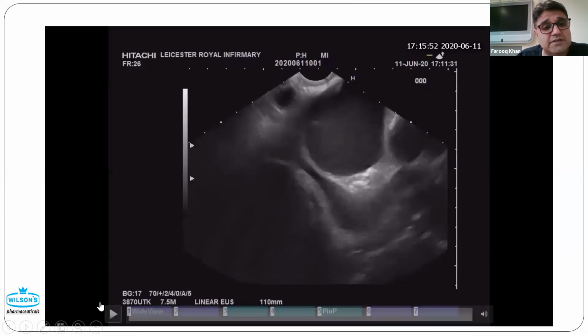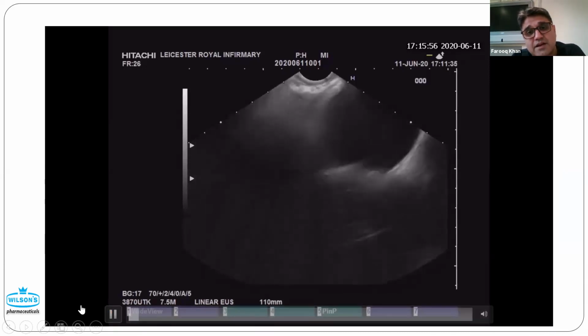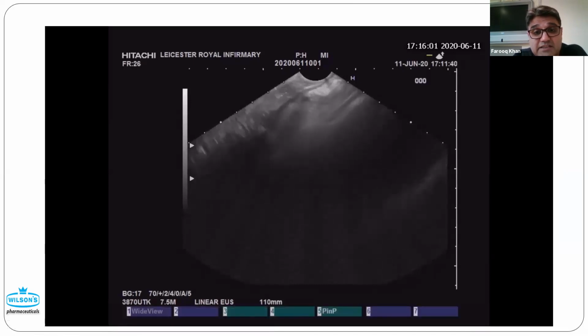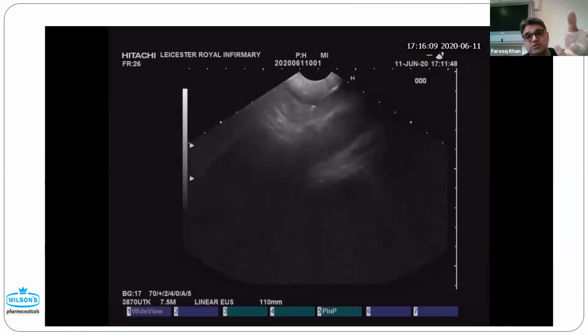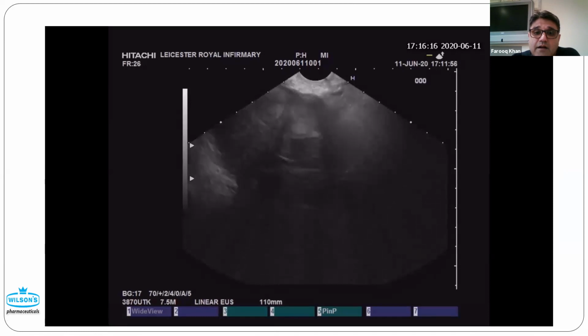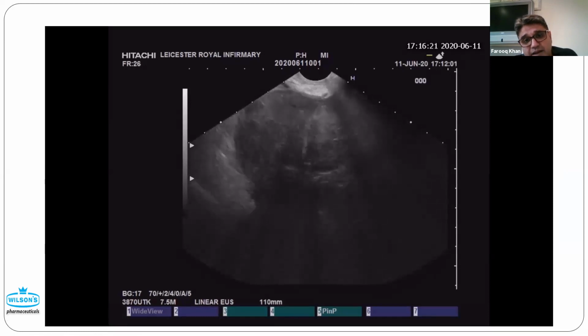He was then referred, after he failed a biopsy, to myself, and as I've gone past the heart, normally when you push there, the first thing you get is the liver, but the mass was so large that I couldn't possibly get it. I really had to take the big wheel completely away from me to straighten it, and then I just saw the tip of the liver. So push the scope just a centimeter in, and you now have this fairly large lesion in front of you.